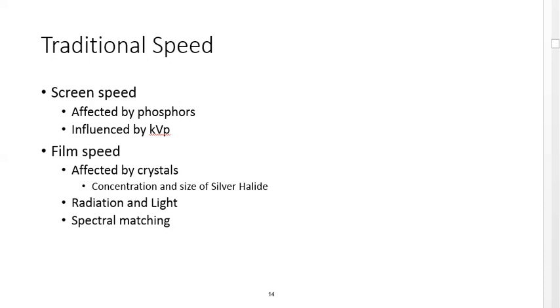In absorption of those x-rays through basically photoelectric interaction, electrons would be ejected from the phosphors that made up the active layer of the screen. The electrons would be ejected, and then they would slip back into their shell, and that loss of energy, or loss of electron and the reestablishment of that electron, would cause the screens to glow.